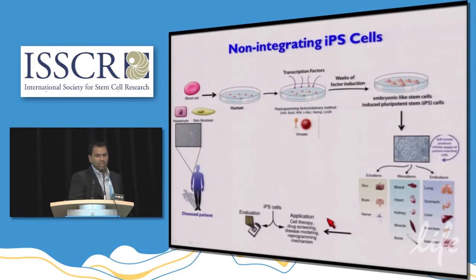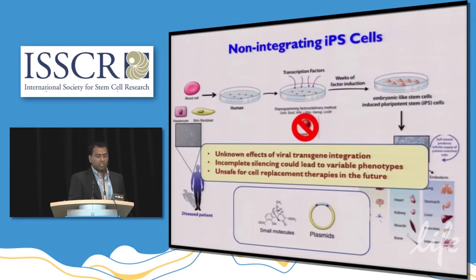So in the Cedars iPS core, early on, we started with lentiviral technology for reprogramming iPS cells, but that quickly dissipated as newer technologies came about. In the end, our reliable system was the episomal plasmids in combination with small molecules to enhance the efficiencies of reprogramming.